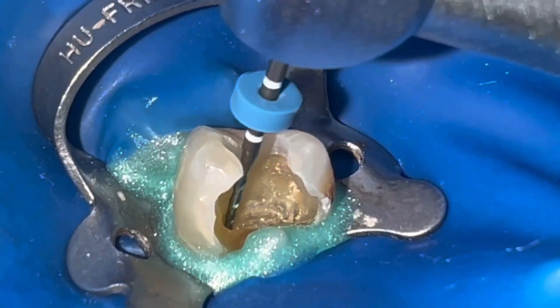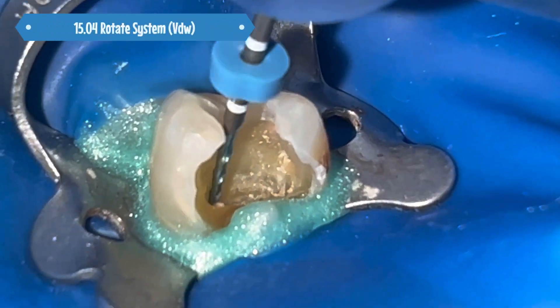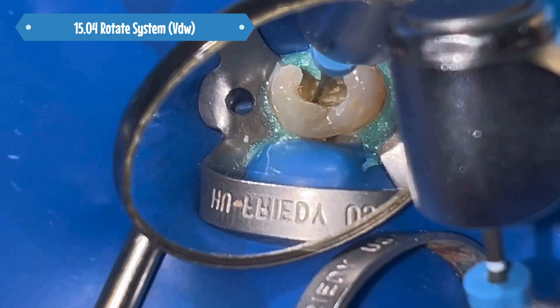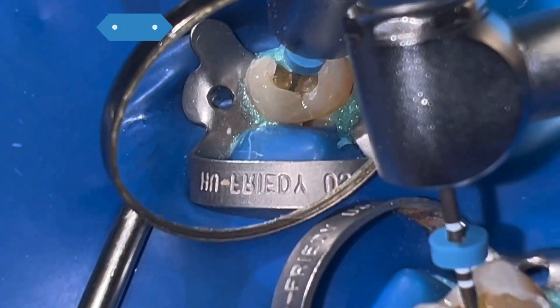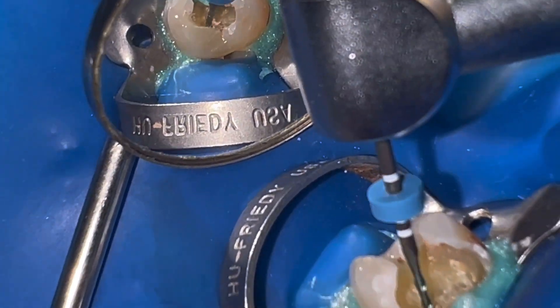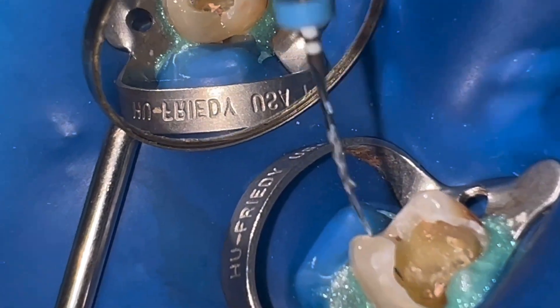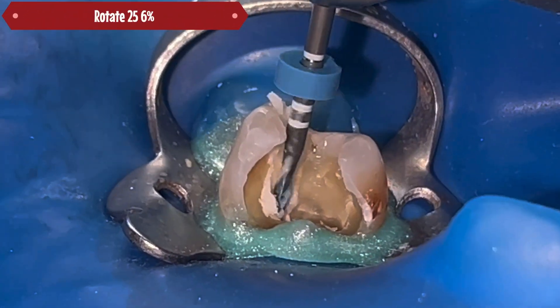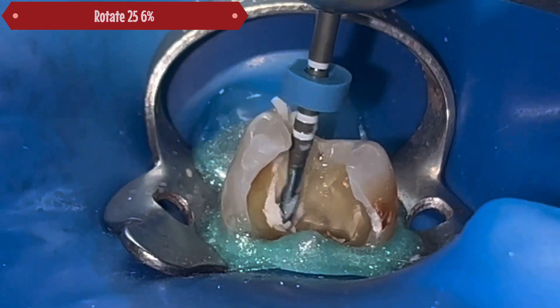Once I have achieved the glide path with a size 10 file, I begin with the basic rotary sequence: 15, 20, and 25. In this brand you also have the 25 file at four percent if you wish.